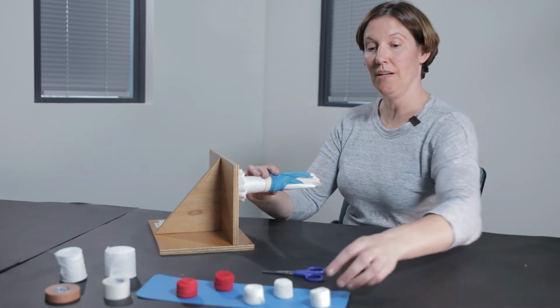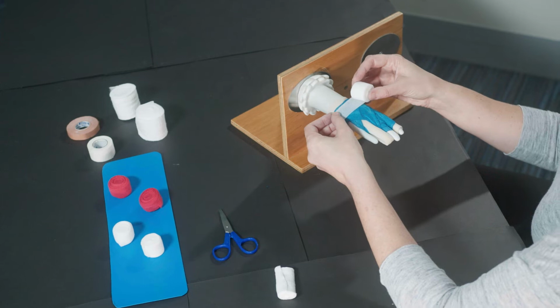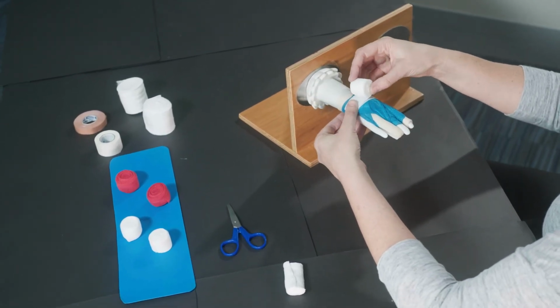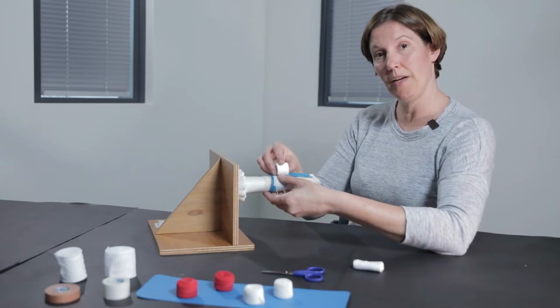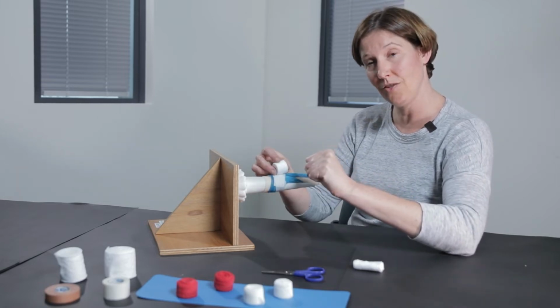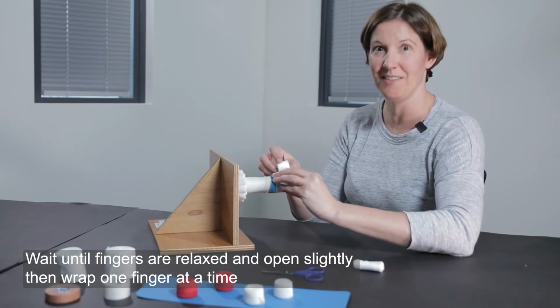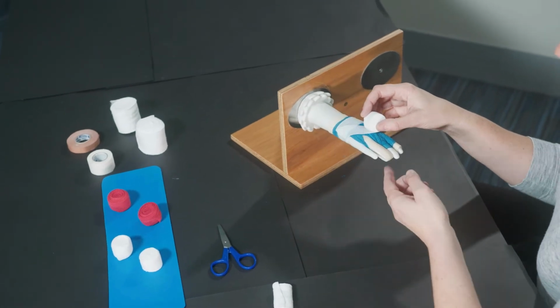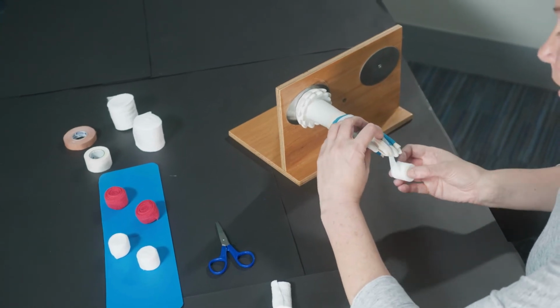The other strategy, and what I'll demonstrate now, is with your wrap, again just starting and going around the wrist, making sure that it's secure, wrapping with your roll on top, and then just stopping and waiting at the back of the hand. So the fingers will close, they might clench, and you will be waiting here for just a short time, or it might be a long time until those fingers open again. Once those fingers start opening again, you may have someone holding here at the tip. You're going to just do your normal wrap to get around the finger, okay?